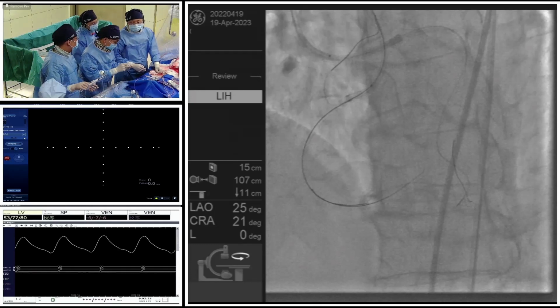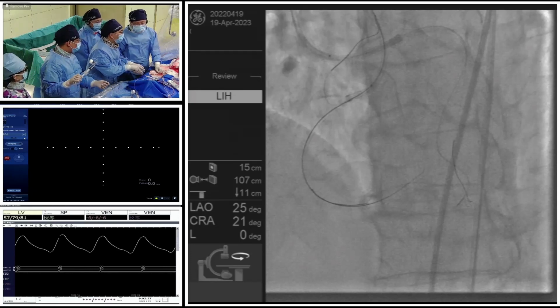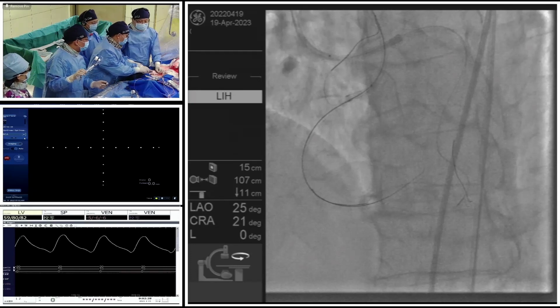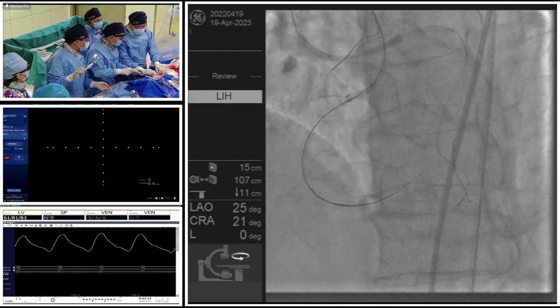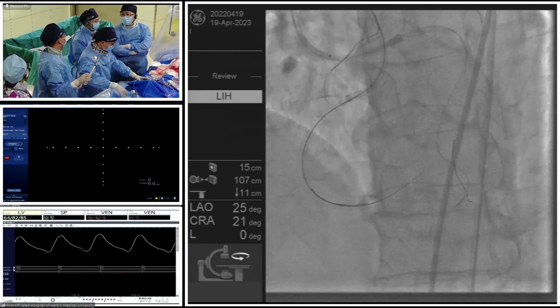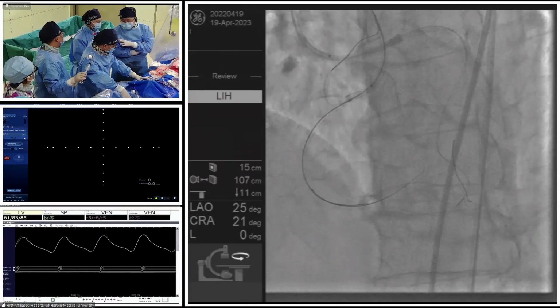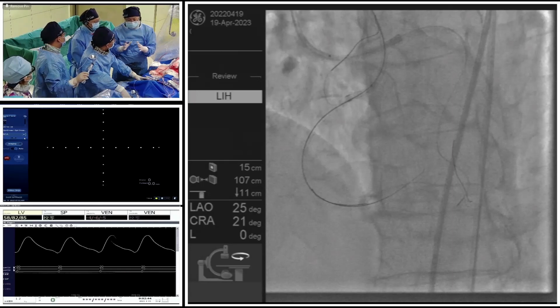And also, we can see that the antegrade puncture failed because the wire went into the subintimal space, so we need a clear direction, with the retrograde wire as the landmark, that finally the antegrade wire goes into the true lumen. So for the next case, we also use a 3D reconstruction app for the operator to see all the calcified lesion distribution.